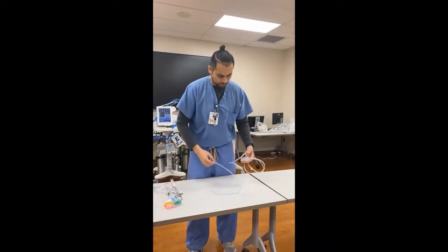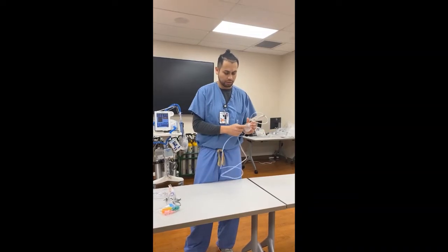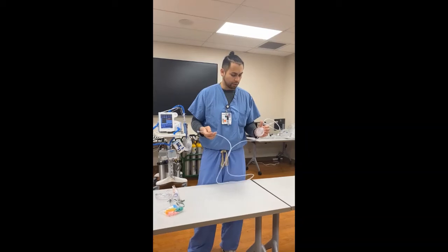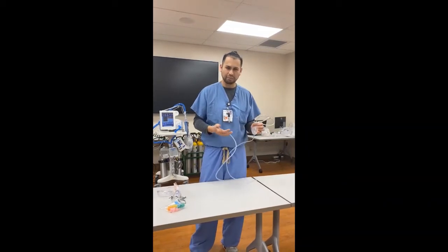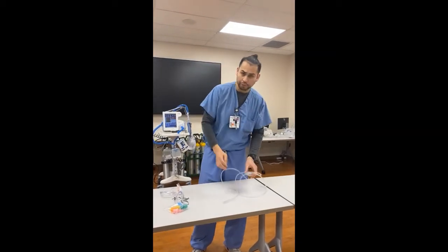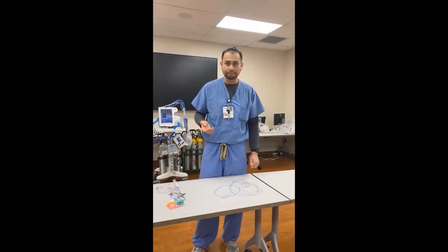Some do nots with this: we don't want to humidify it, because humidifying will fill this little pendant right here with fluid, and it will cause some discomfort for the patient. Anytime they inhale, they will get some water in their nose. So this device should not be on a bubble humidifier, nor should the non-rebreather or the Venturi mask. The only device that should be on a bubble humidifier for patient comfort is the nasal cannula.